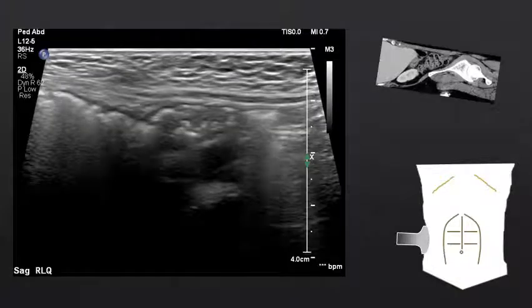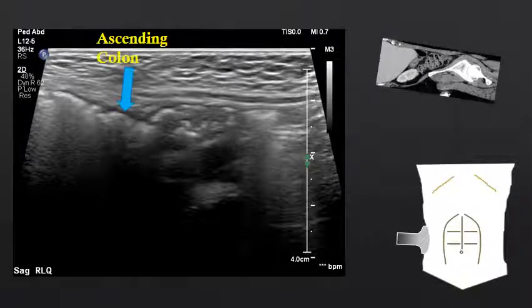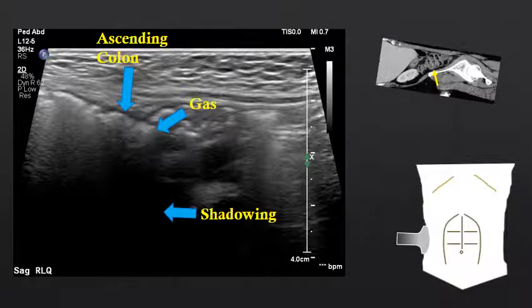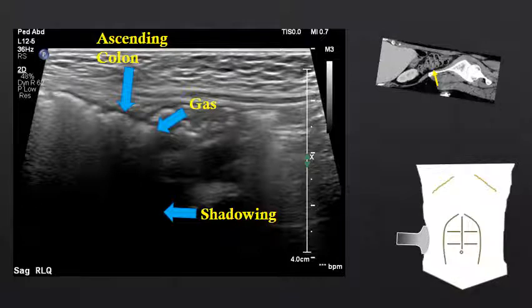Moving up to the mid-abdomen in a sagittal or coronal orientation, we can often identify the ascending colon. The colon tends to be more gas-filled than the small bowel, and in this case the gas is causing dense posterior acoustic shadowing, obscuring the structures deep to the colon. When someone has a lot of gas in their colon, the colon can often obscure critical structures such as the pancreas, the bowel, or even the kidneys.